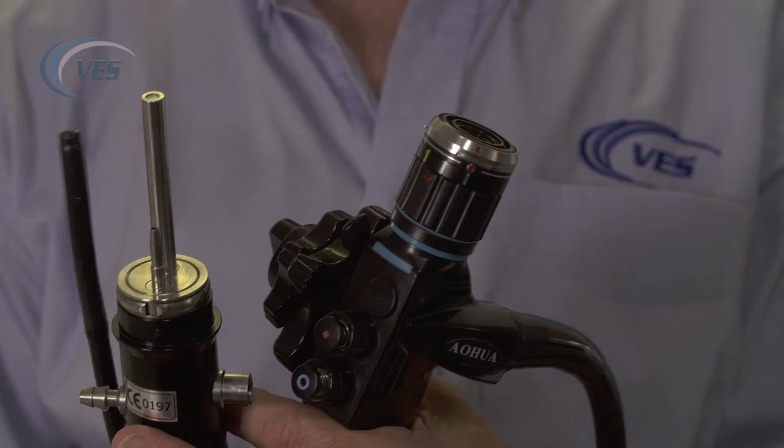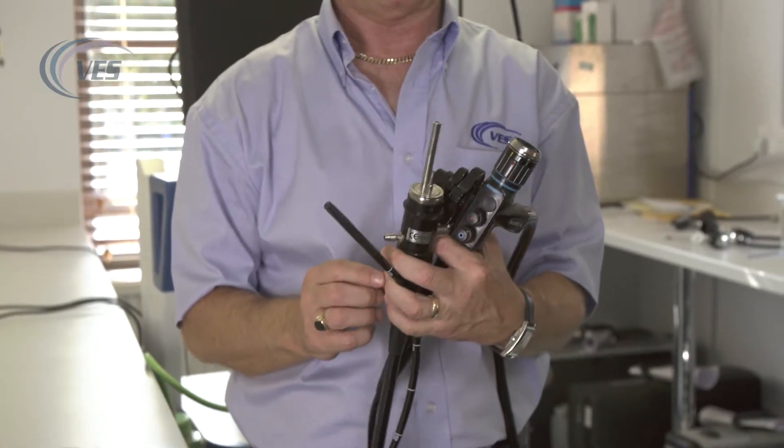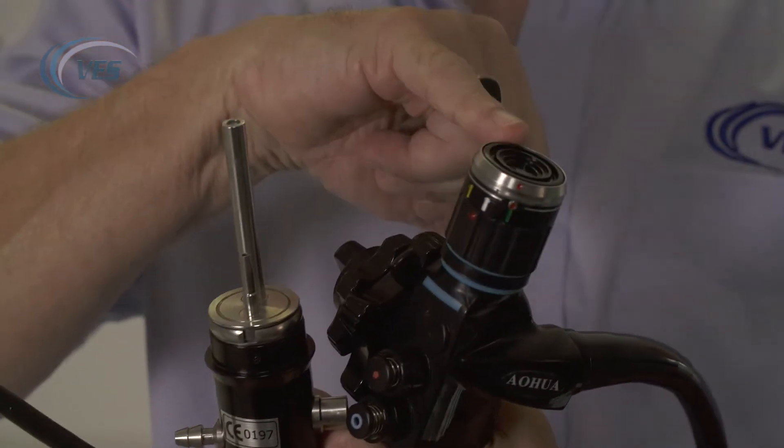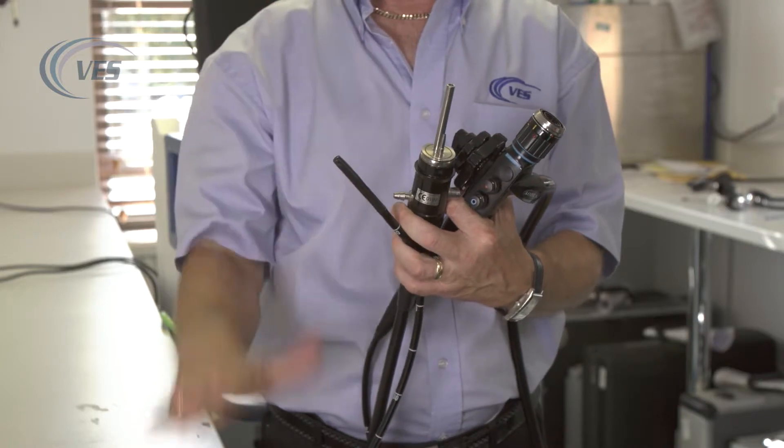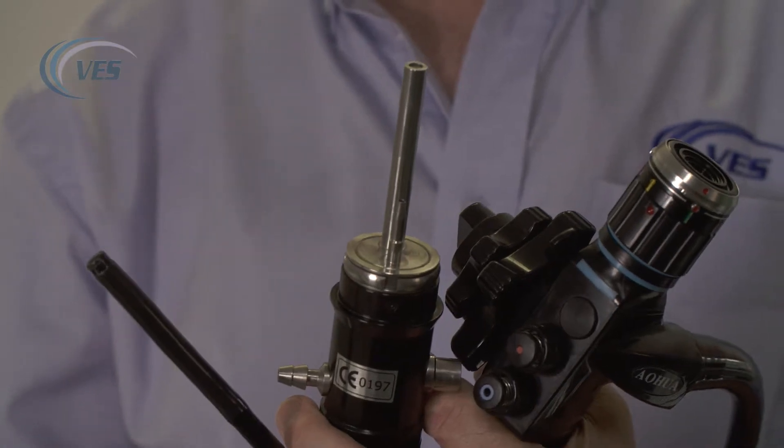Your main danger areas of any scope are going to be anywhere where there is glass and metal. That is, your distal tip, your light guide post, and your eyepiece. Avoid dropping or hitting any of these parts on a hard surface or table.